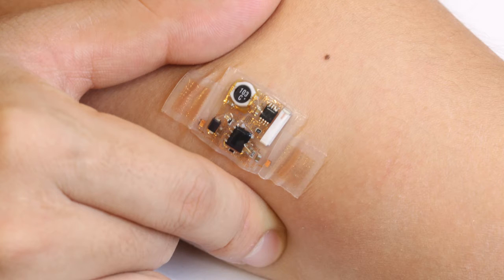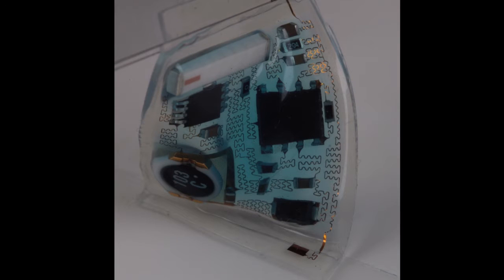A new technique by Sheng Zhu and colleagues, which involves miniaturized assemblies of sensors, circuits, and radios suspended in fluids, seems to open the door for the next best thing.